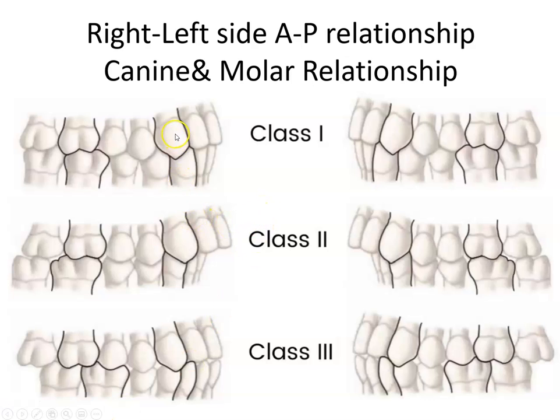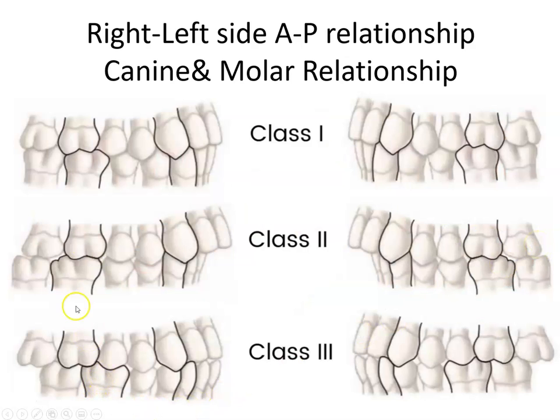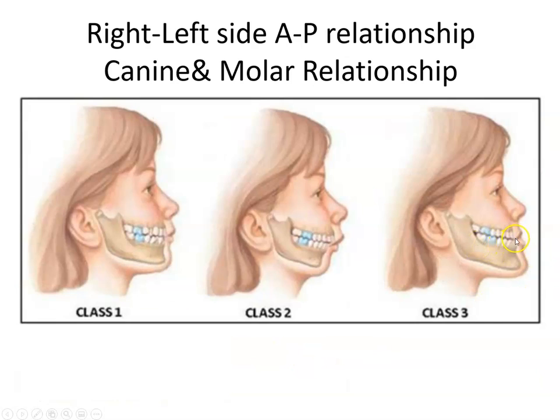The key point is just to look at the 2 reference points. I always say look at the top 2 teeth, and you can see since the jaw is shifted forward for a class 2, the top tooth is in front instead of the bottom teeth being in front. On a class 3, since the lower jaw is shifted forward, you're going to have the bottom teeth, the molar and the canine, way forward in the wrong position as compared to the upper teeth. That's because the jaw is shifted forward and you're bringing everything forward.